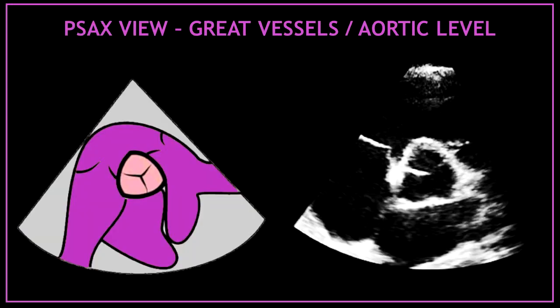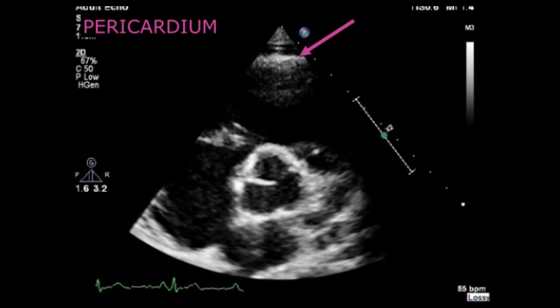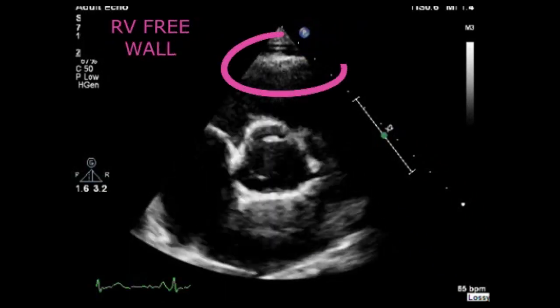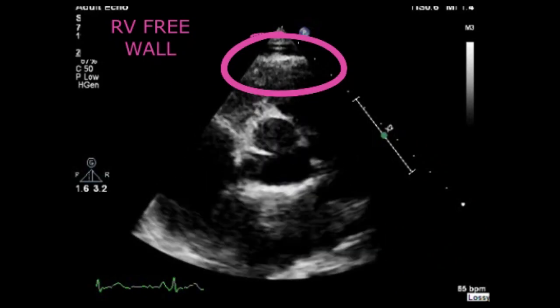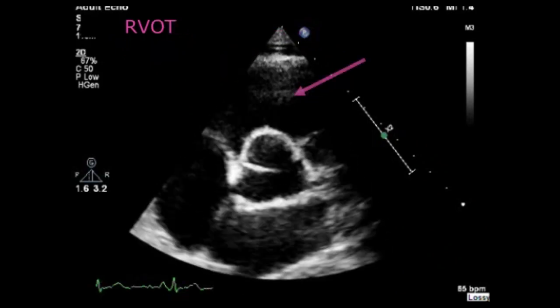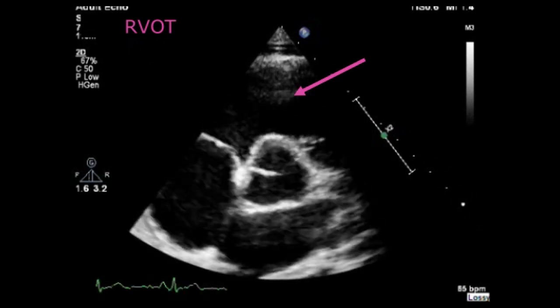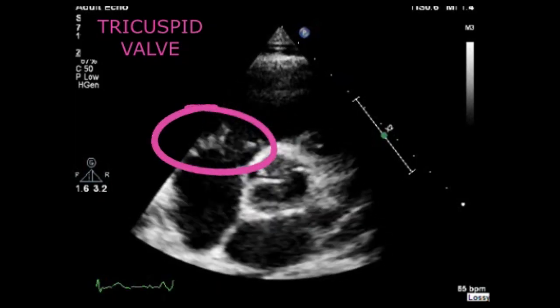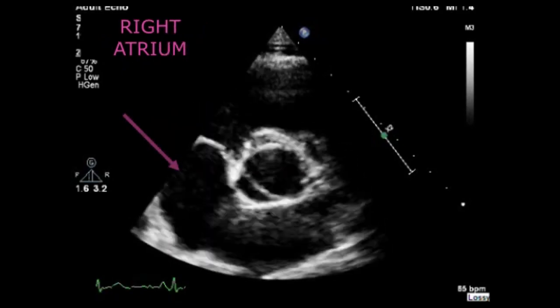Now I'm going to show you on a video, one by one, all the structures we can visualize in the parasternal short axis view at the great vessels or aortic valve level. That very anterior bright and thin line is the pericardium. Under the pericardium, this thicker segment corresponds to the right ventricular free wall. Then you can visualize the right ventricular outflow tract.